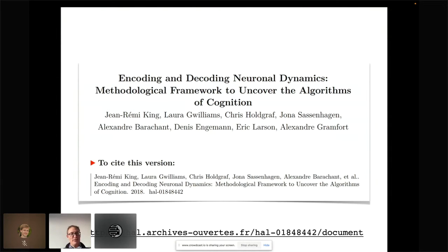All right, machine learning on EEG and MEG. I want to do a bit of commercial and advertise a paper written by a number of the MNE folks who worked on the decoding submodule of MNE-Python, where we discuss, with a number of references, the so-called encoding and decoding paradigms on neural dynamics, so basically electrophysiology, EEG and MEG.